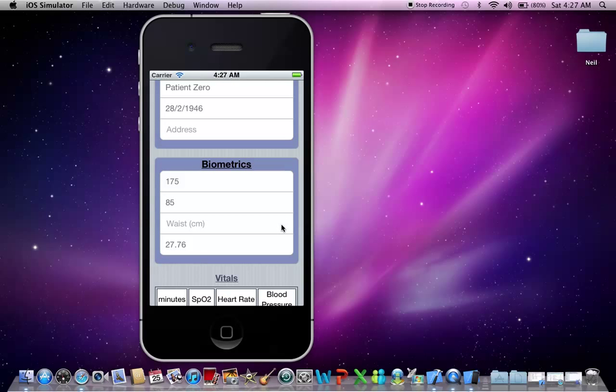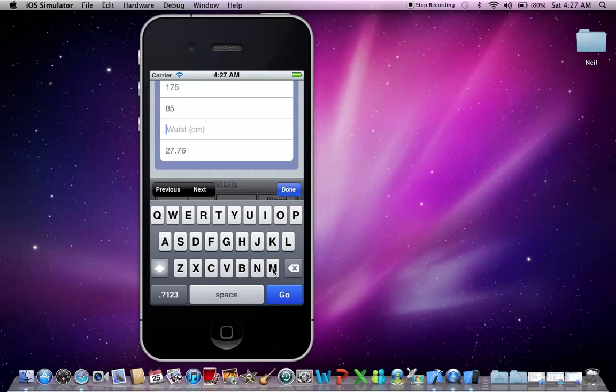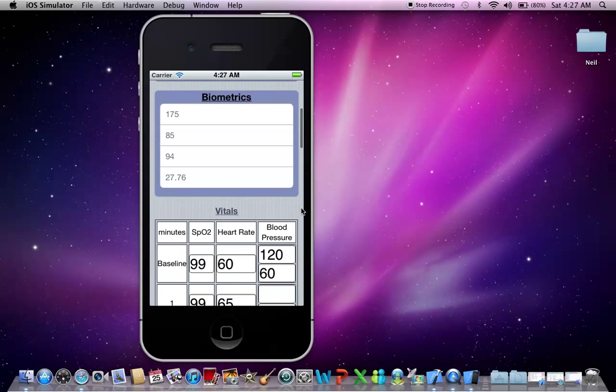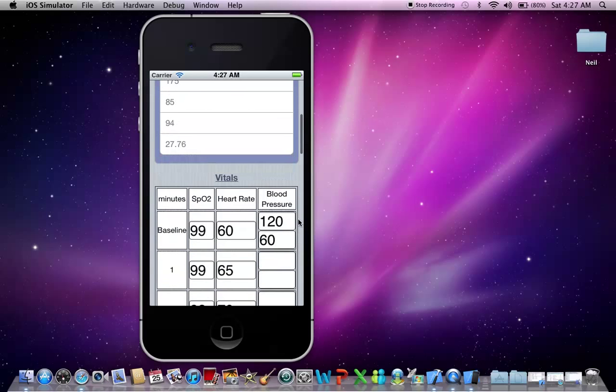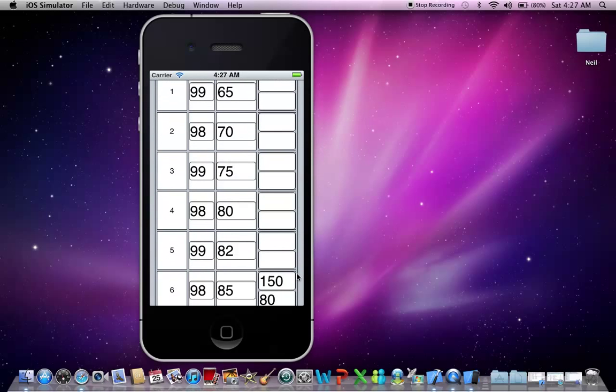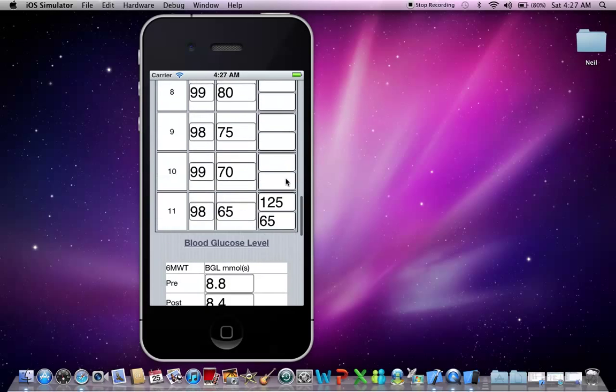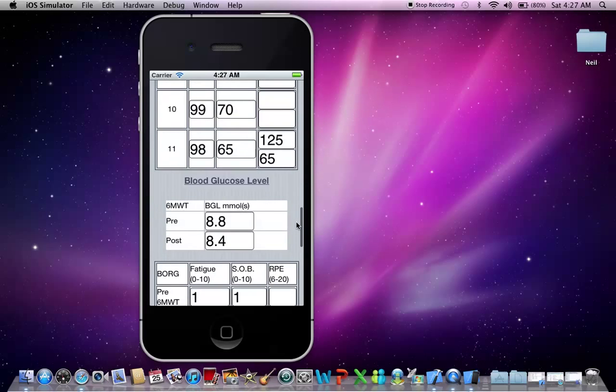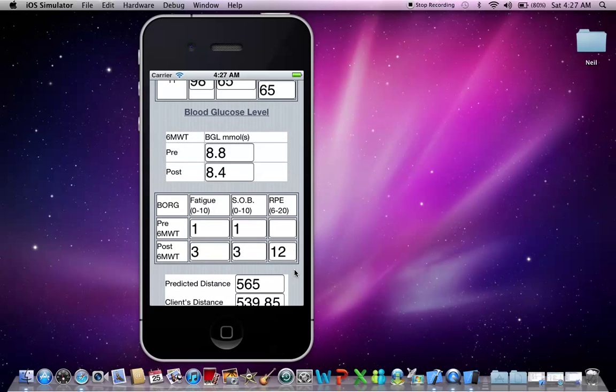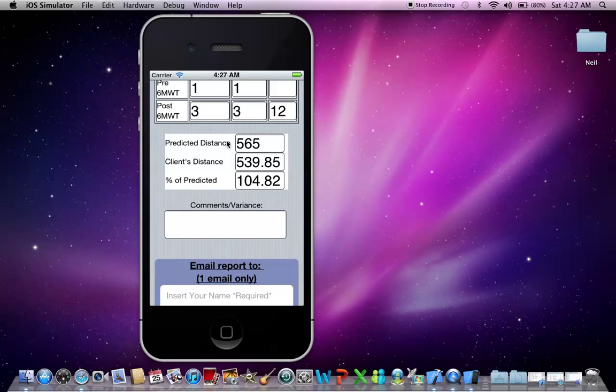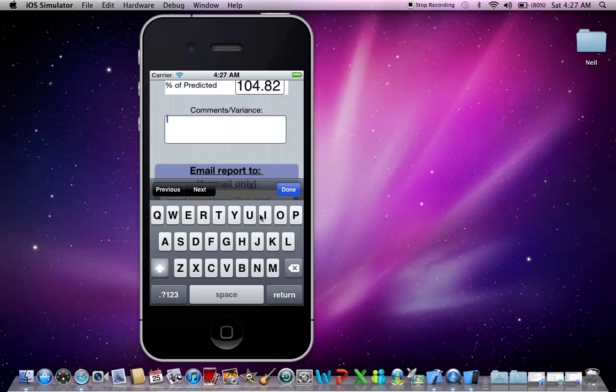Let's put in a waist measurement. Let's say 94 centimeters. Okay, and as you can see the height, the weight, and the BMI have been transferred over, as well as all the vital signs that we recorded, and also the Borg scale, and also the initial assessment values here. You also have a comments box here, which I'll put in a comment.